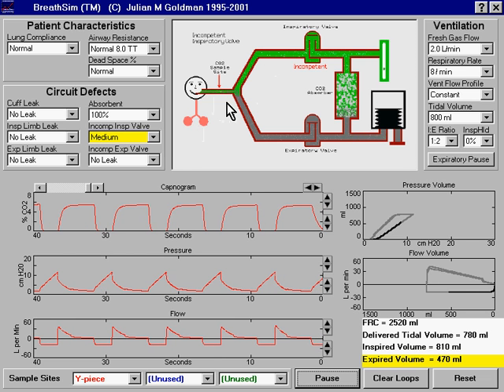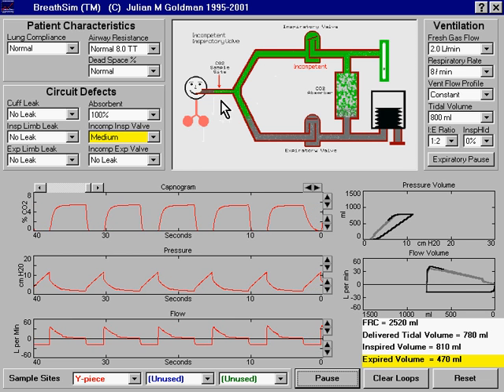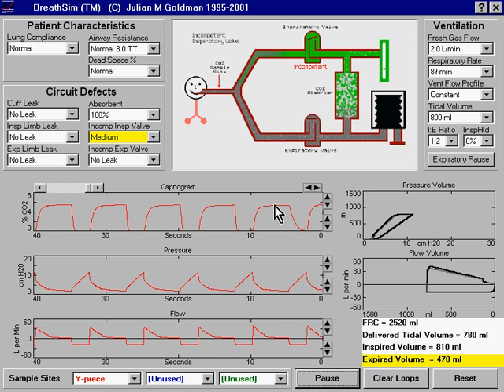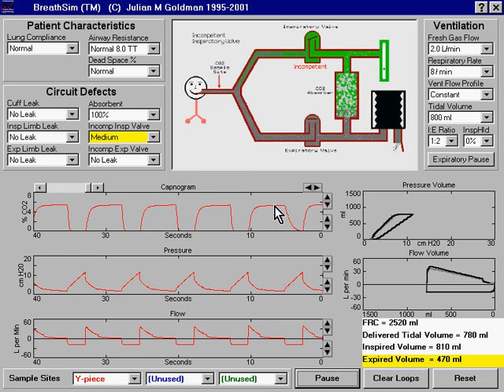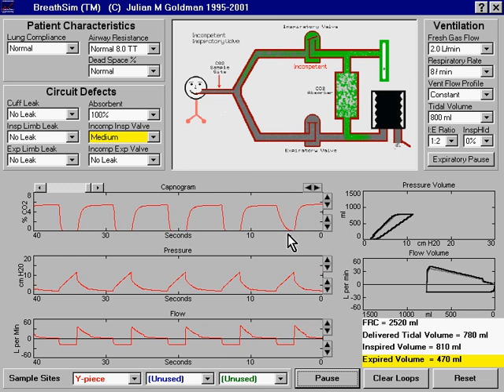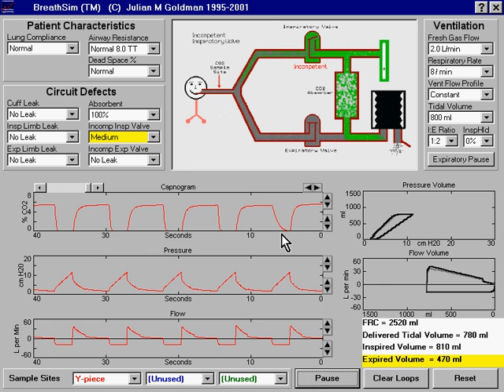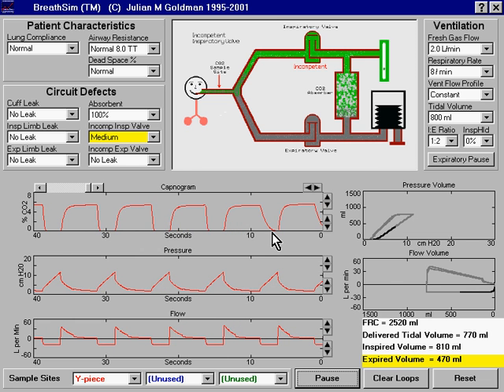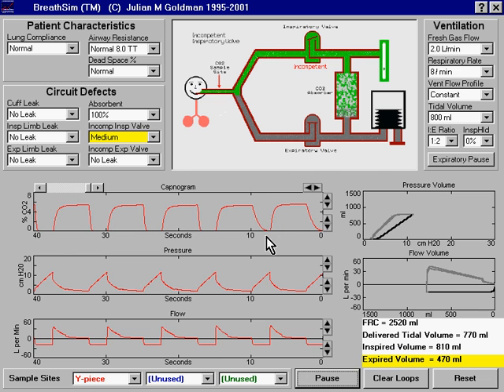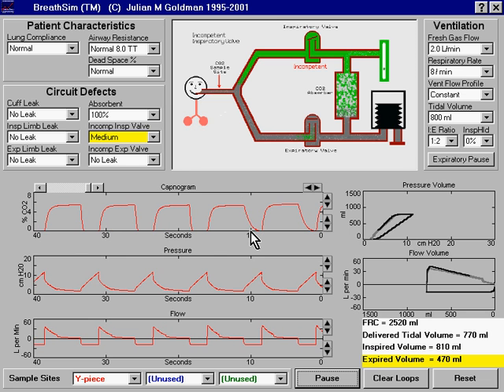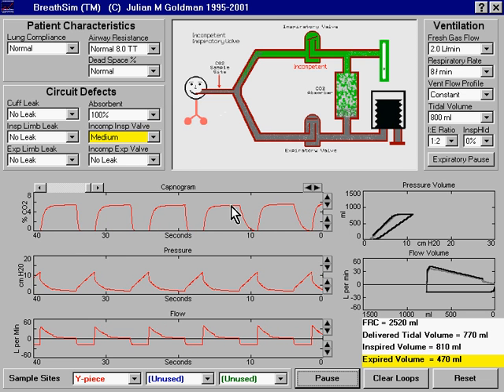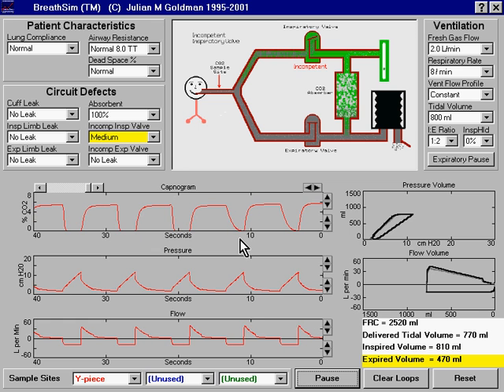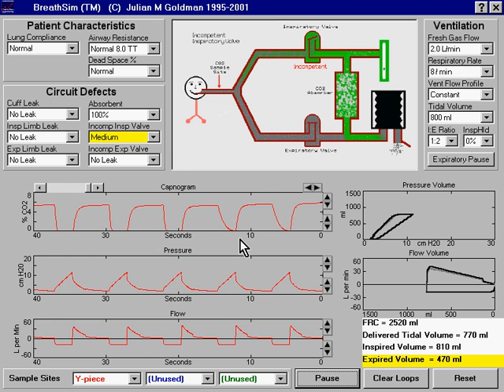The rebreathing of CO2 delays the downslope of the capnogram, because the capnogram won't drop all the way to zero until all the CO2 has been rebreathed — the CO2 that was sitting in the inspiratory limb from the previous exhalation. We can see that there is a prolonged delayed downslope on the capnogram when the inspiratory valve is incompetent.